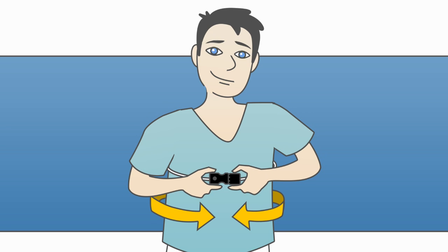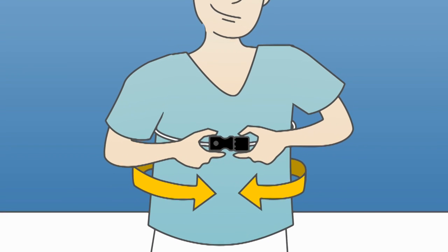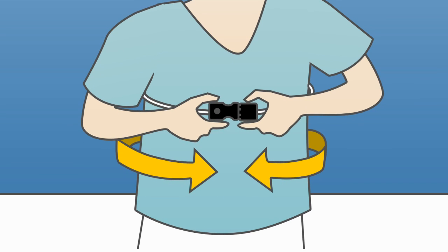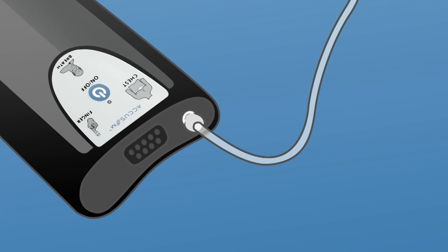First, attach the chest sensor by connecting the black clips around your body. Adjust the belt so it fits snugly under your breasts. Then connect the other end to the AccuSum.